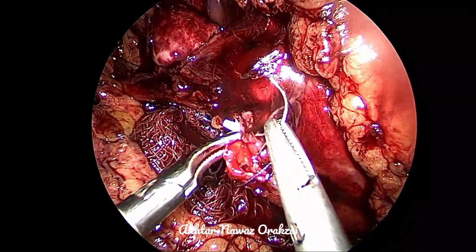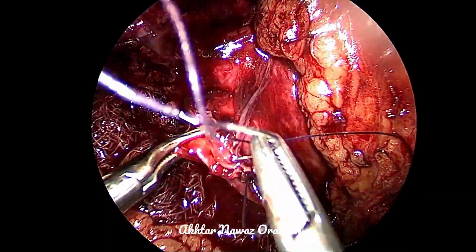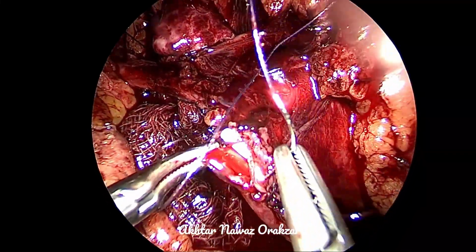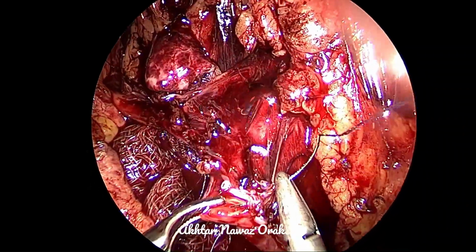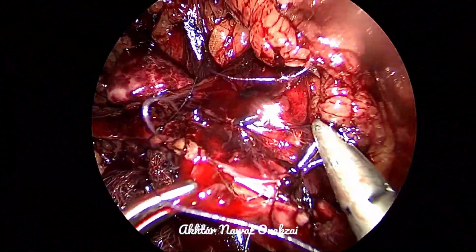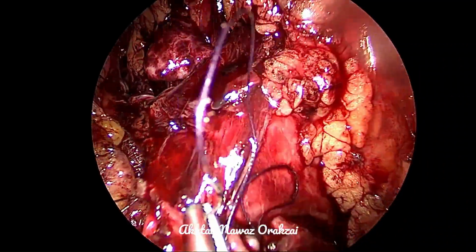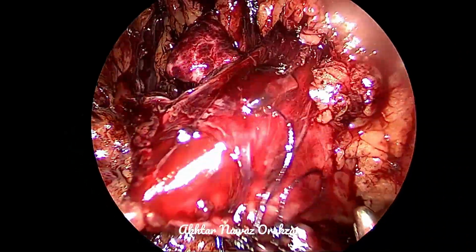The drain will remain there for 24 hours. So if it doesn't drain anything significantly, we can remove the drain after 24 hours and send the patient home with the catheter. The catheter will remain there for a minimum of 1 week and a maximum of 10 days, so that the patient does not develop any intrarenal or intrapelvic pressure while micturating and making the anastomosis leak.